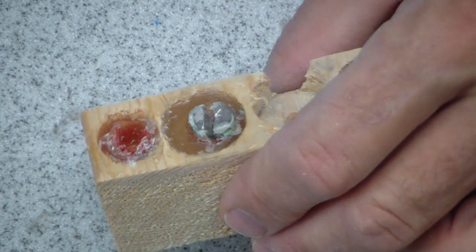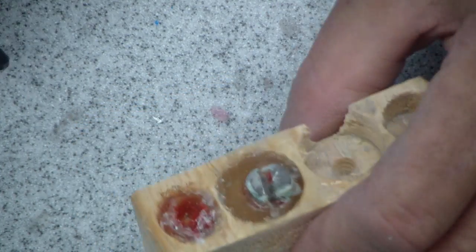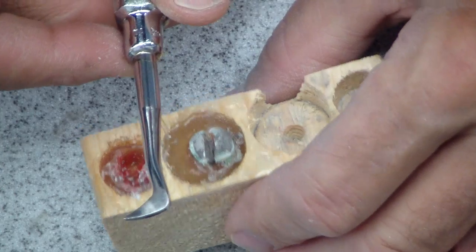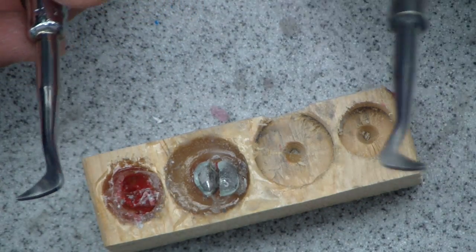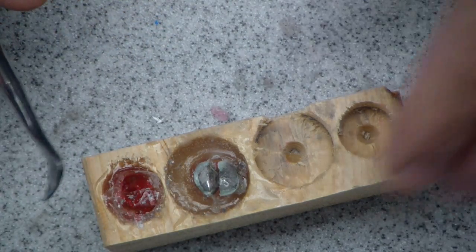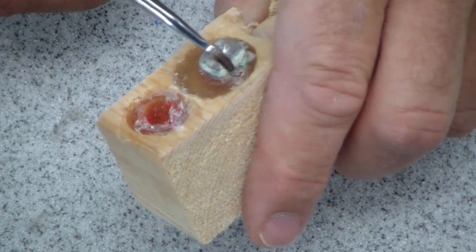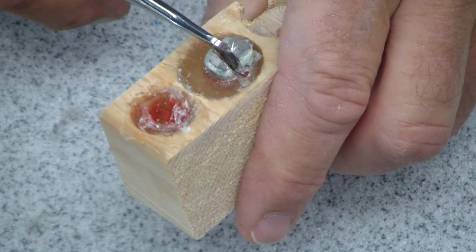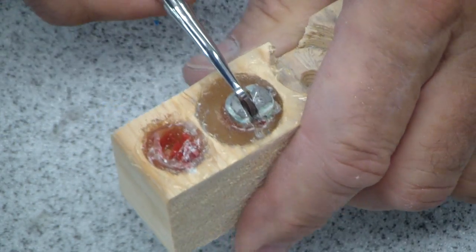The other instrument you can use, especially for a root tip that's broken off down on these mandibulars, is the crier, or sometimes they call them the east-west. They come in a pair. And these will slip down in there and elevate these. It may not work real well on this tooth because of the crown on there. They're better for the root tips than the whole crown.